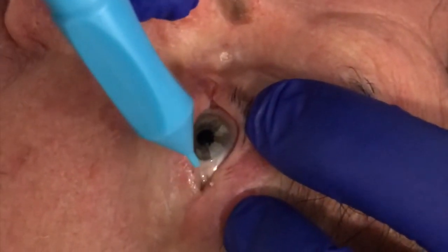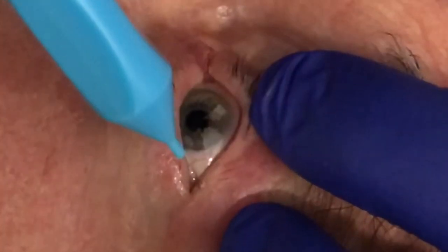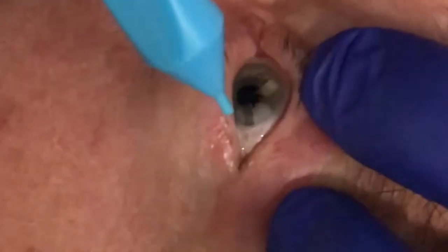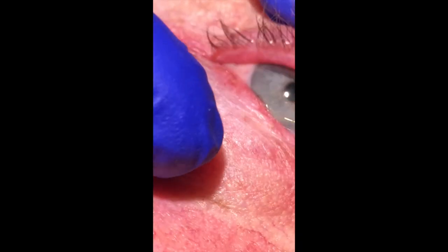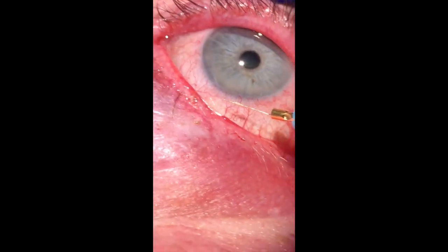If the hair is pulled out when there is resistance, it will be no different than simple epilation and the hair will regrow. The achievement of complete follicle ablation will be seen when the hair floats out of the follicle on the needle.